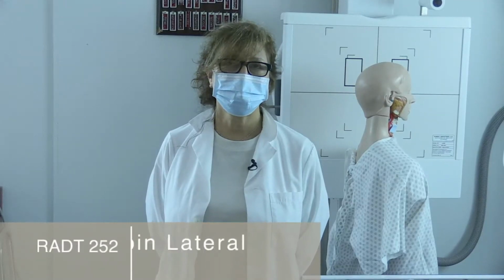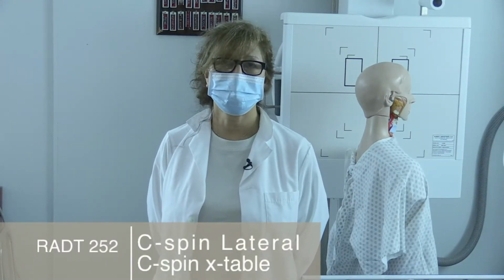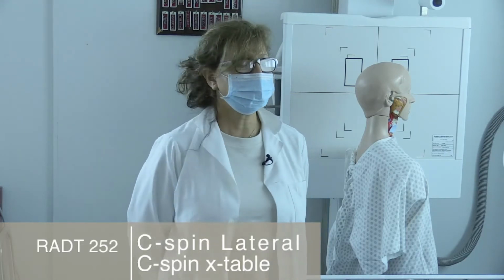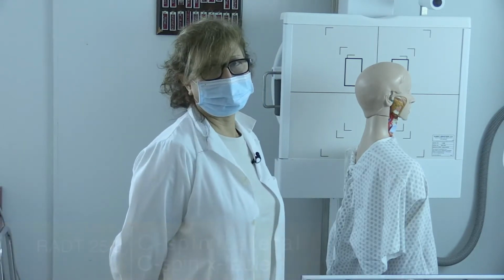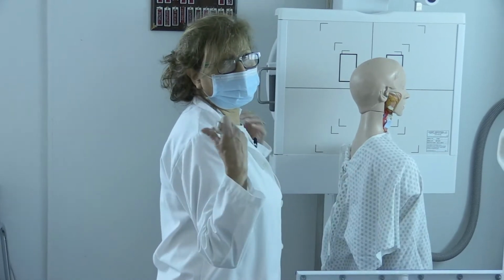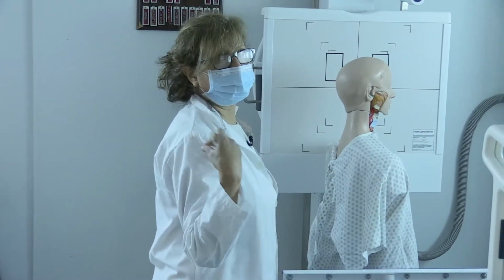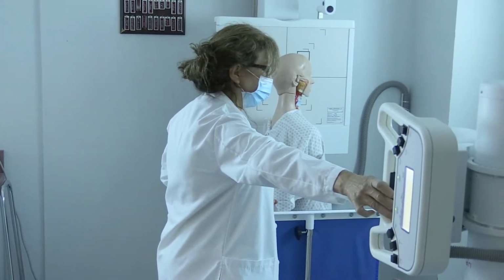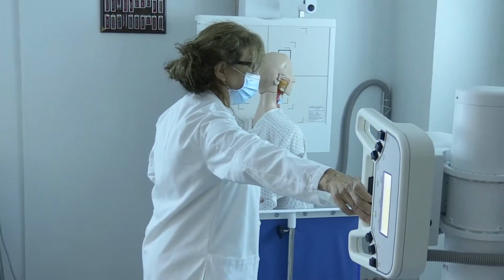We're going to position for lateral C spine and cross-table lateral C spine. We're going to start with an SID of 72. This allows for the magnification of the shoulders to be reduced. And I have placed my X-ray tube at that level.